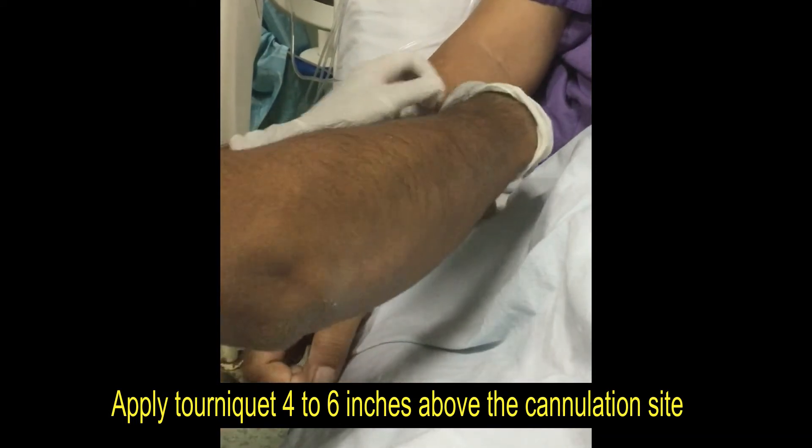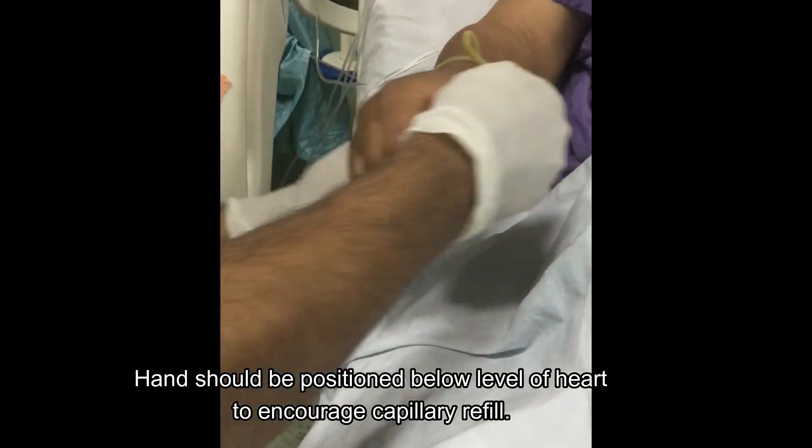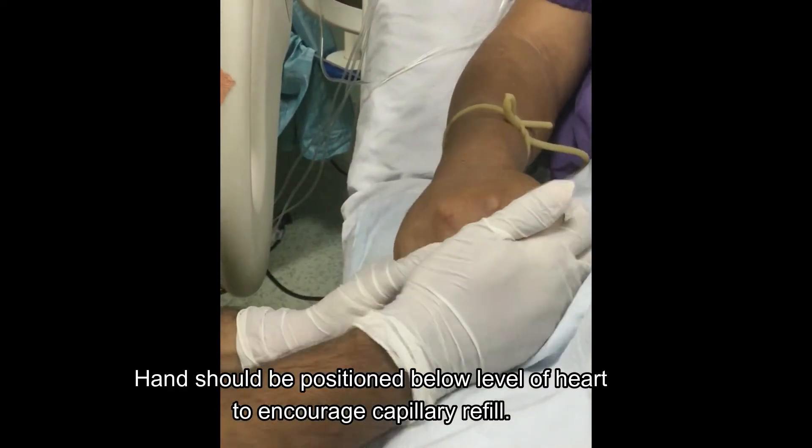Apply tourniquet 4-6 inches above the cannulation site. Clean the site with cotton and spirit.